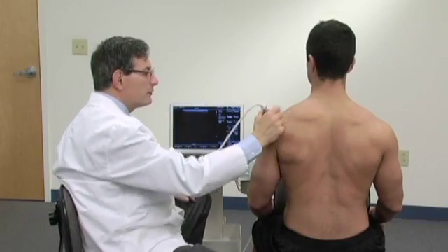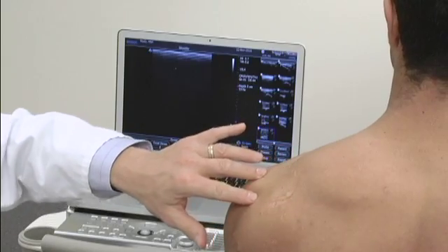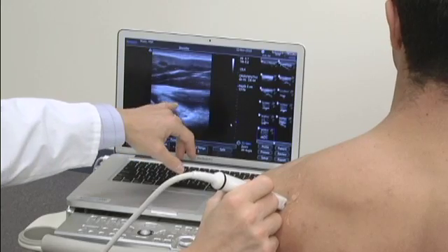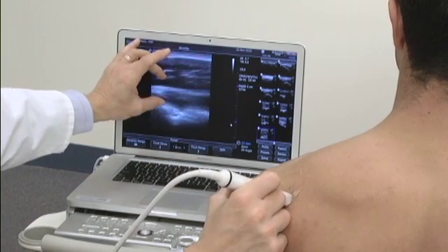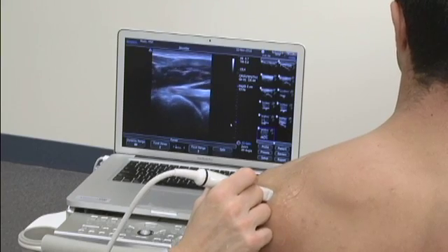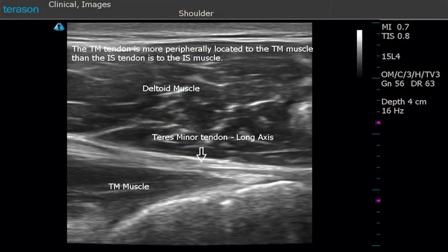Next, we're going to look at the infraspinatus tendon. That's easy enough to do because we'll just find the spine of the scapula and place the probe just underneath it. The infraspinatus tendon tends to be a centrally located tendon. If we follow it back into the infraspinatus muscle, we'll see muscle on either side of it as a bipennate-type muscle meeting up to the tendon. We can then follow the tendon laterally to where it inserts on the posterior and middle facets of the greater tuberosity of the shoulder.